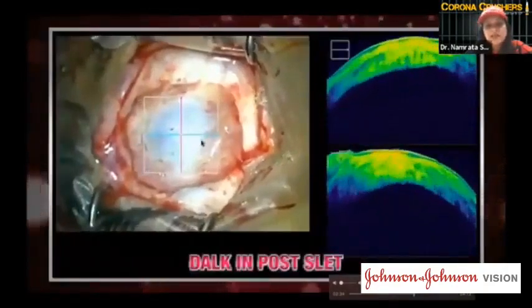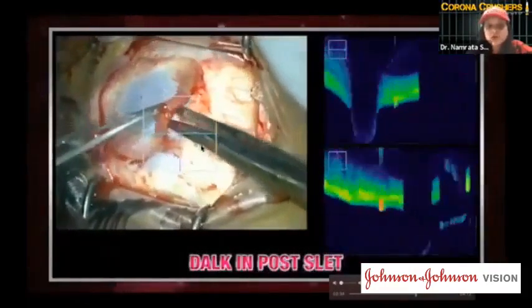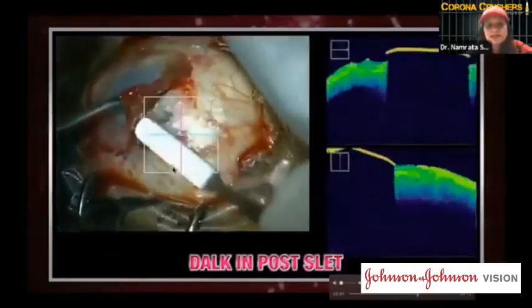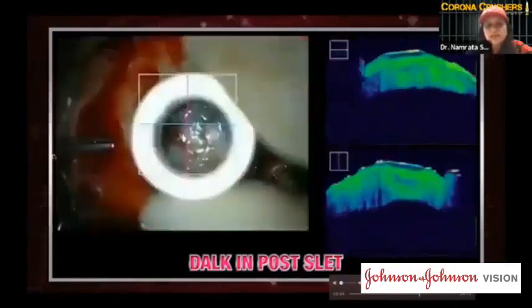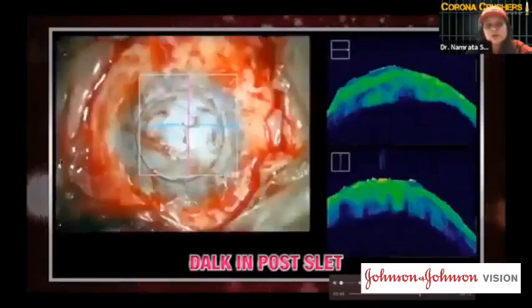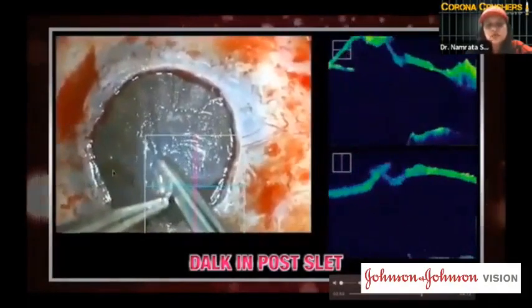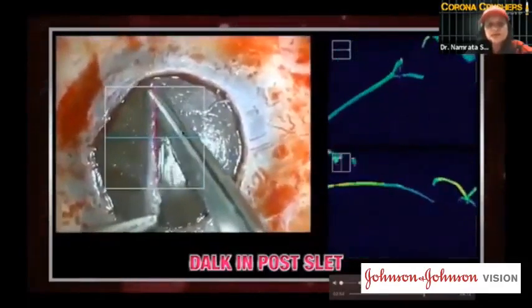Again, in this case, where is the eye there? So you again have to dig out the eye there and also dig out for the patient to see. So again, you remove the pannus, and sometimes when you're not that fortunate and the underlying cornea is a little bit hazy, there you can do a partial thickness transplantation. And again, notice that as you remove the overlying stromal layers, they're just waiting, they're ready to be stripped off.